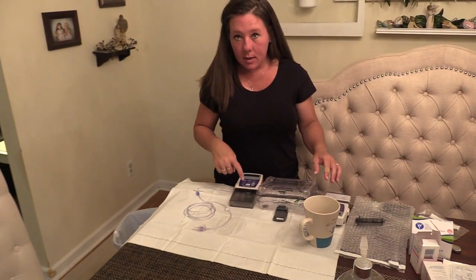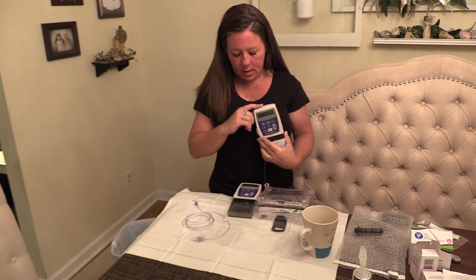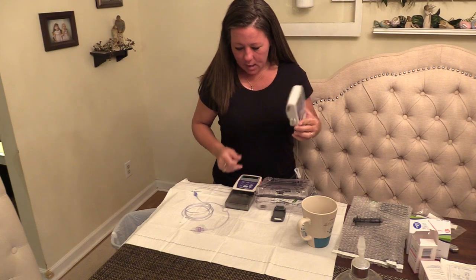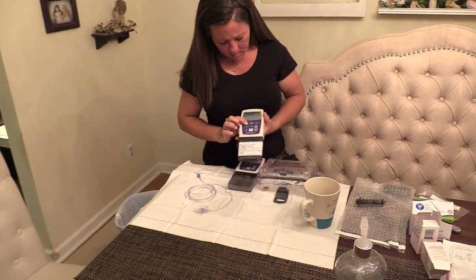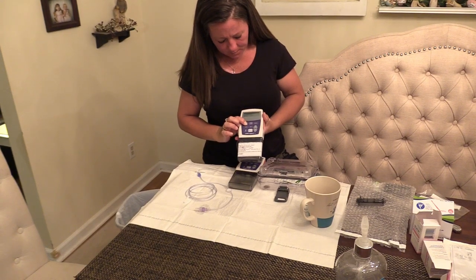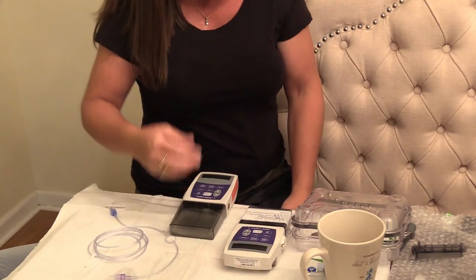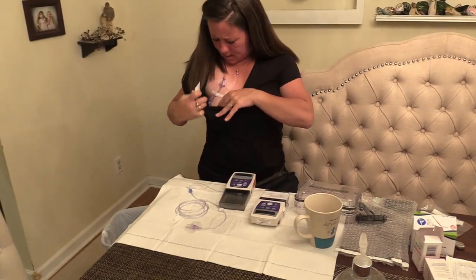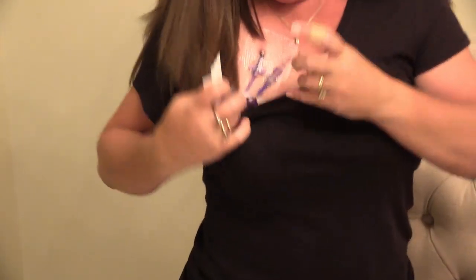Now we're going to change from the pump I'm using right now to the new cassette that's full — so this one's ready to go. With this one, just press stop and hold it in. It says stopped, and since we're changing the whole thing it's going to connect right at this point.